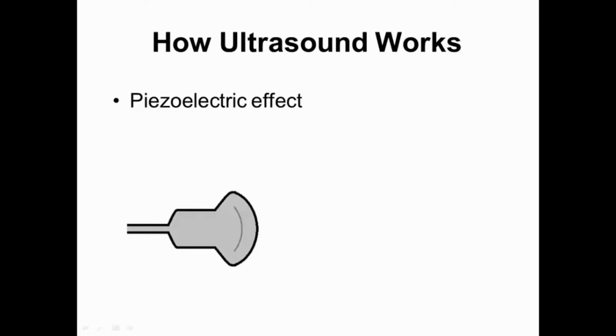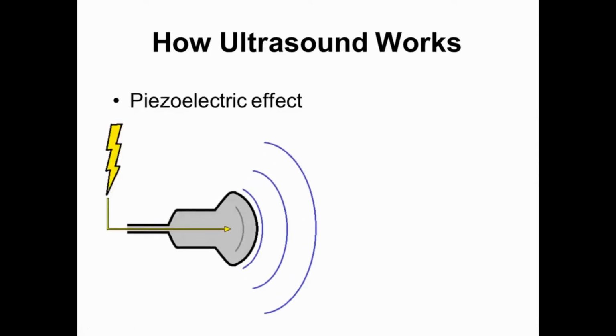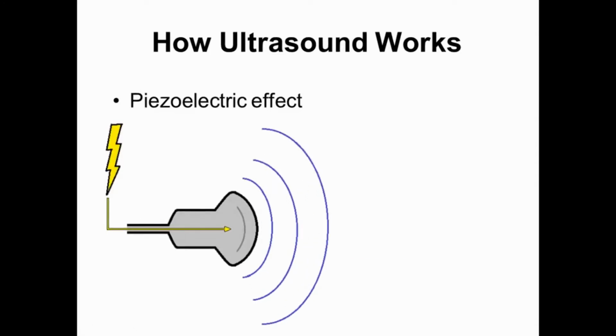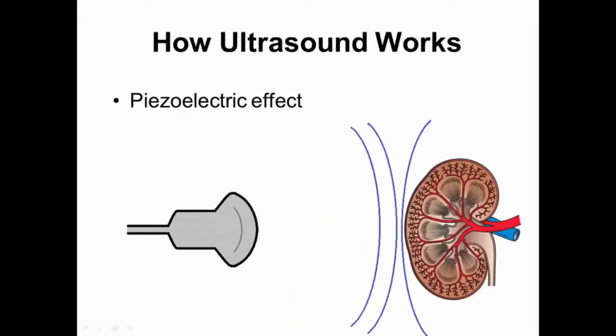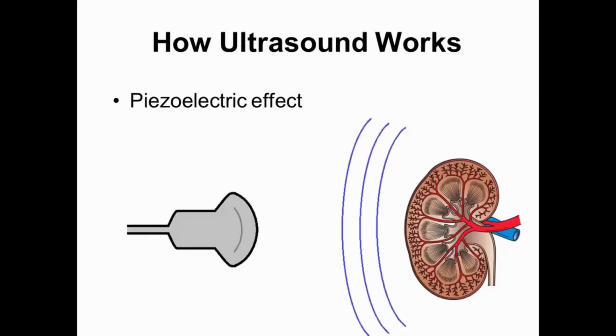Each ultrasound probe contains piezoelectric crystals, which have the properties just described. When electrical pulses are applied to the crystals, they rapidly vibrate and produce ultrasound waves. This process exemplifies the forward direction of the association just described, in that electricity is used to create mechanical ultrasound waves. These waves then travel into the tissue where they are reflected back at variable times and intensities.